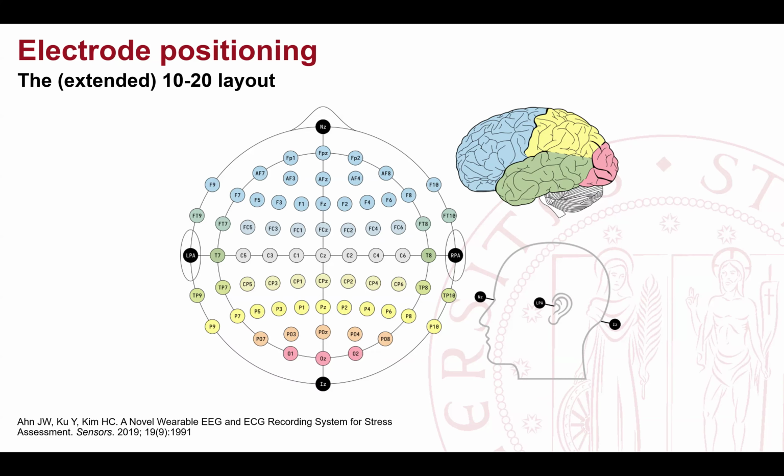But not necessarily. It can also be another EEG channel. The reason why, for example, they use CZ as a channel is because the aim was to go for mobile EEG, so an EEG that you can use while walking. The problem is that when you walk, you have this movement of the head, and this enters exactly into the EEG. You would see in the EEG signal exactly the wave of your movement when you move your head while you walk.